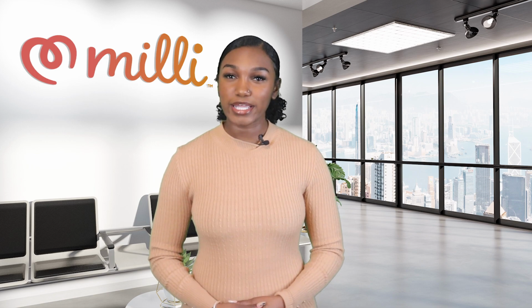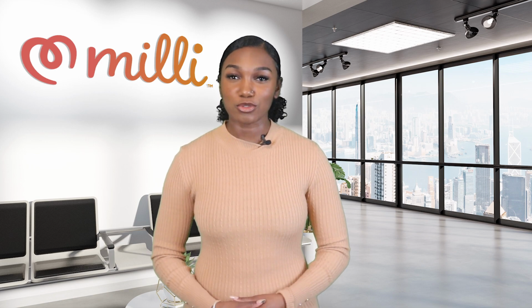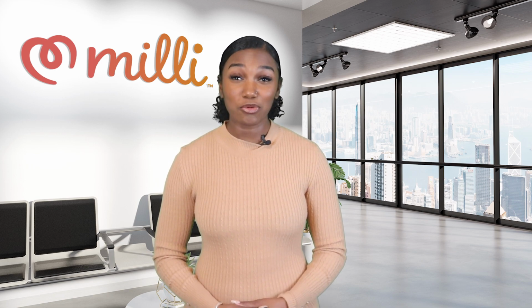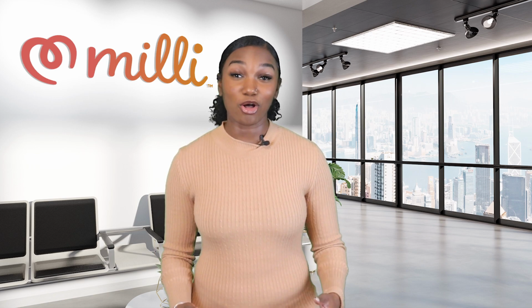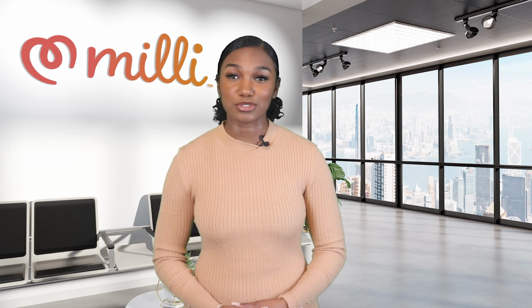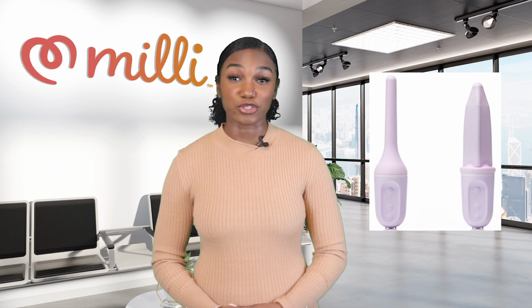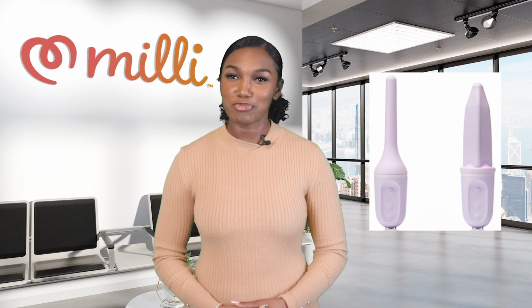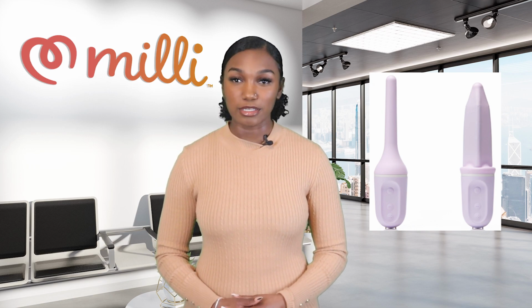It may be helpful to lay reclined with your knees apart and pillows supporting your head, back, and legs. If your pelvic muscles are very tight, it may be helpful to insert the wand slowly while using deep, relaxing breathing techniques. You may also want to see if the vibration features help you with insertion. Once at least half of the wand has been inserted, gradually increase the diameter of the wand until resistance or tightness is felt, and then pause.